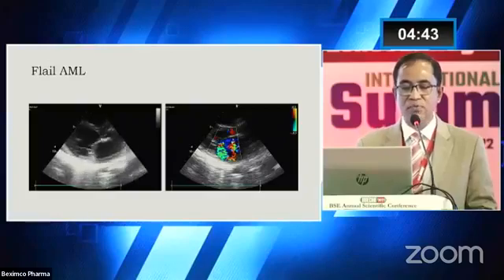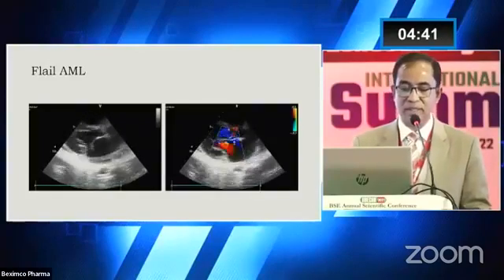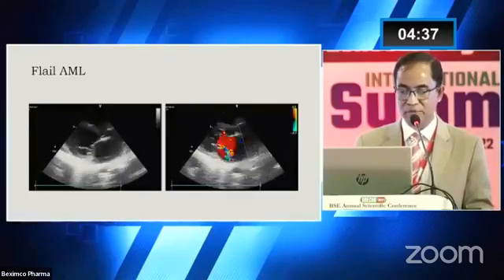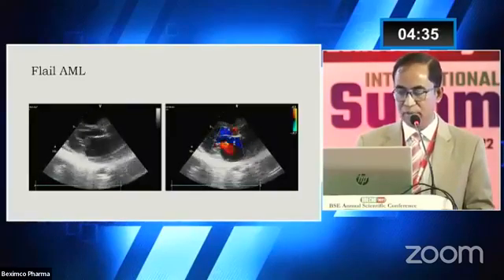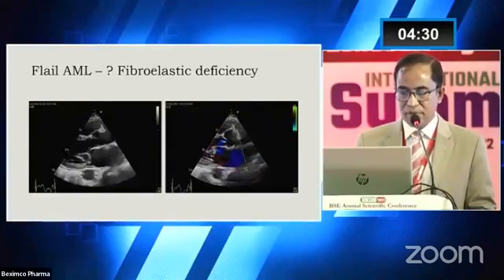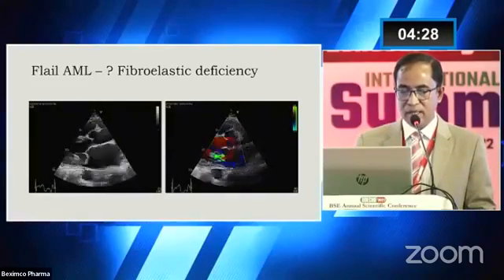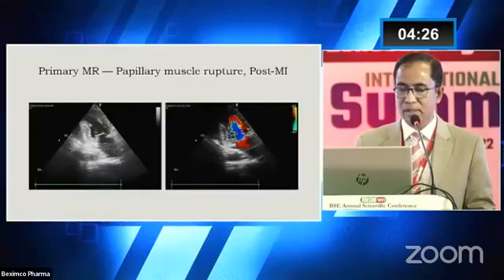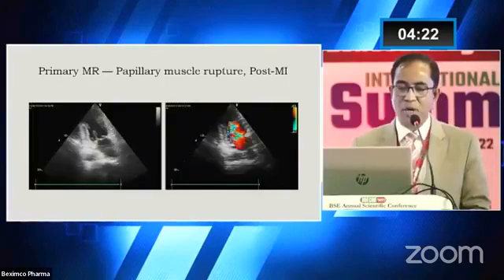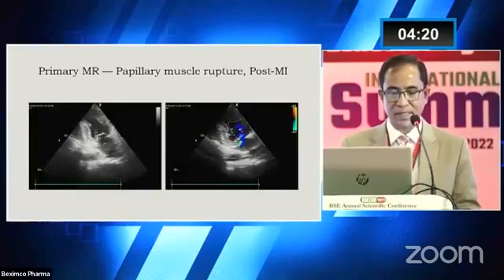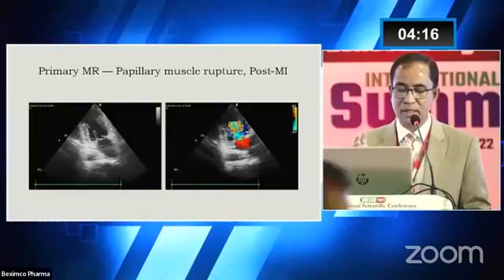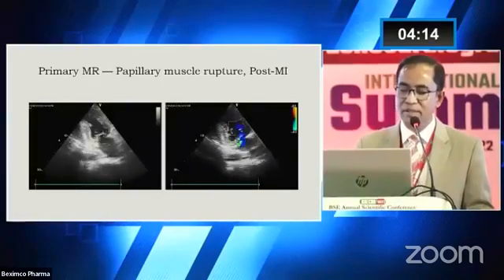This is an example of flail anterior mitral leaflet — you can see that part of the AML is moving within the interior of the left atrium, which is by definition a flail leaflet. This is fibroelastic deficiency leading to flail AML. Sometimes, especially in post-MI patients, there may be papillary muscle rupture, as in this case, where part of the papillary muscle has ruptured, leading to an eccentric severe MR.